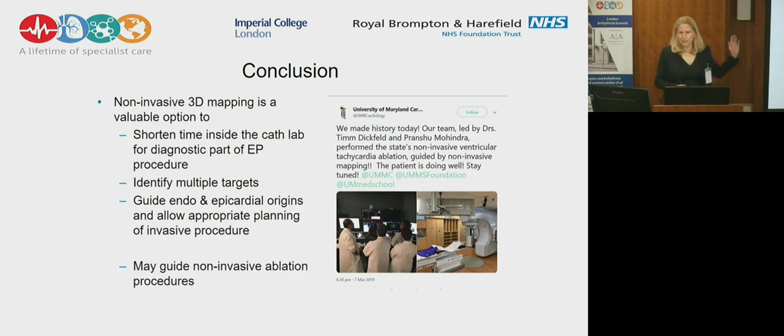And lastly, I want to share with you that picture. You've probably heard about CardioInsight having done that already, but actually this Vivo system has been used now as well for non-invasive catheter ablation. So not only locating where it's from, but also, without putting catheters in the heart, ablating a VT exit site. That is now done in the University of Maryland. Tom Dickfeld and colleagues have done that very recently, and so far we heard the patient is well. And I hope that's going to be the new era for us electrophysiologists, that we don't have to spend 10 hours in the difficult VT case, but maybe we can do non-invasive ablations in the near future.